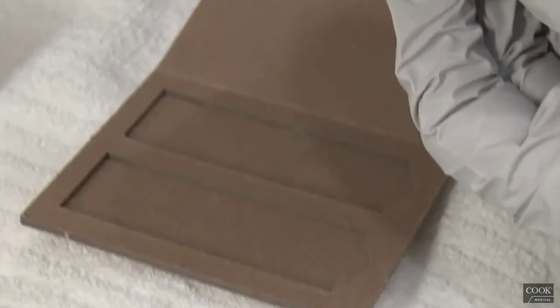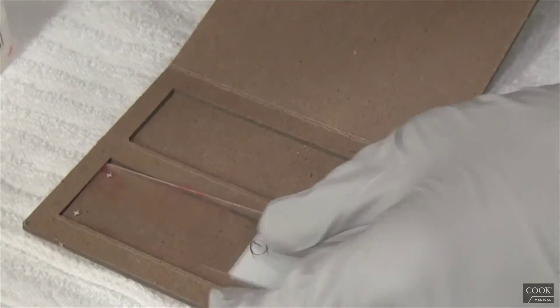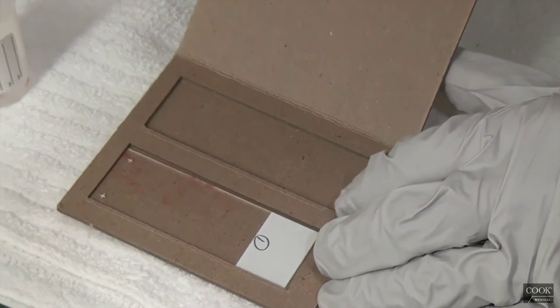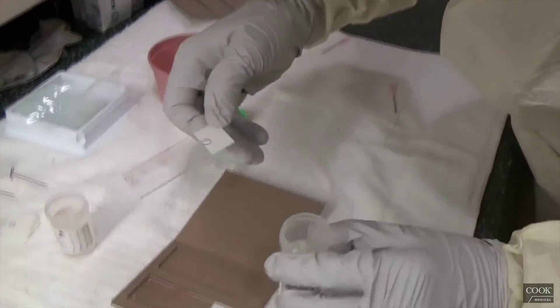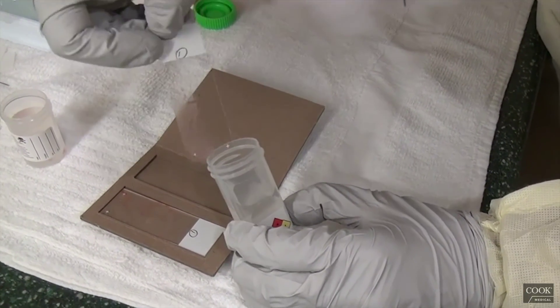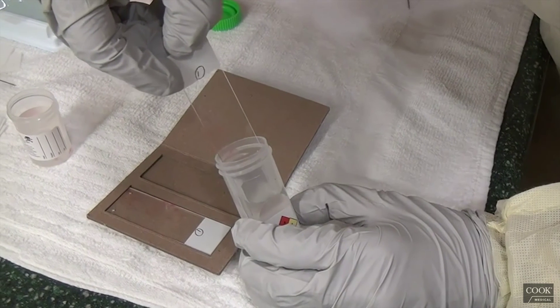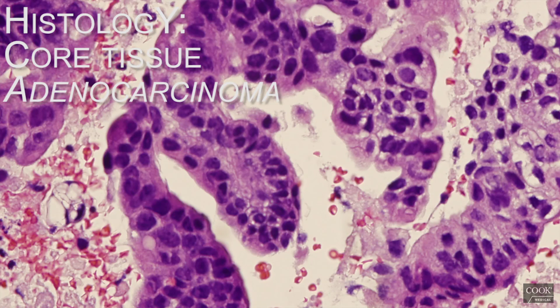We're going to put one specimen for the air dry, which will then go for the diff quick. The second one will go into alcohol for the pap smear. On this first and only pass, the cytology was positive for adenocarcinoma and a true histologic core tissue was obtained.